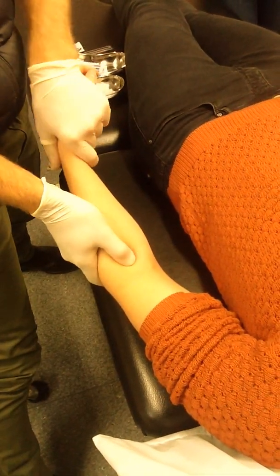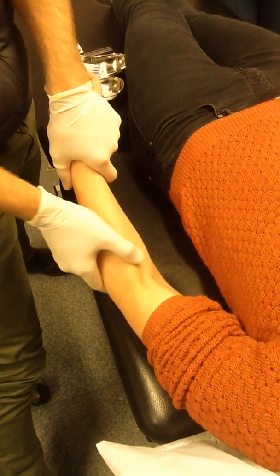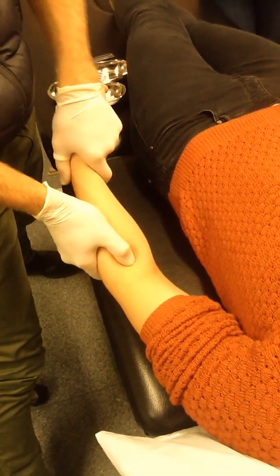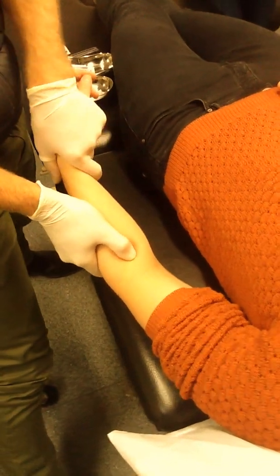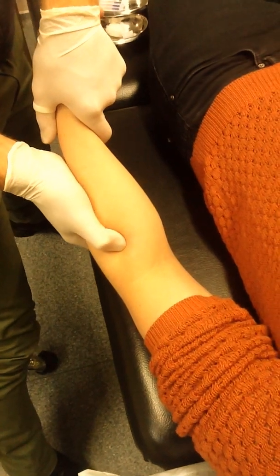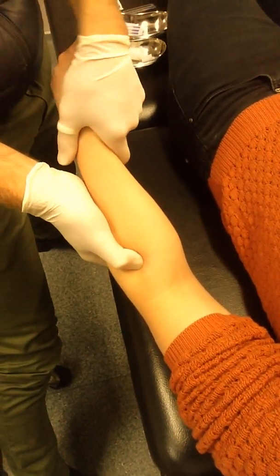The easiest thing is to roll over that brachioradialis. So flex up, let's sit there, roll off it. Roll off — the first one you'll feel will be extensor carpi radialis longus. And then kind of in a gully, almost underneath it and laterally, will be extensor carpi radialis brevis.